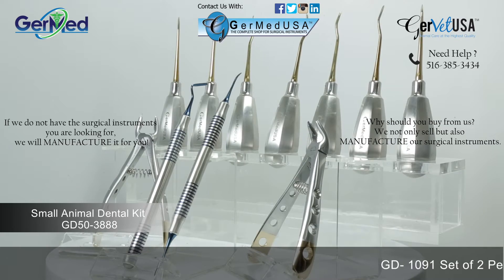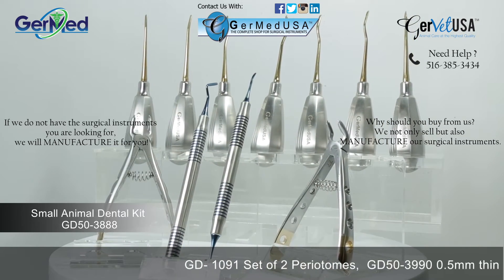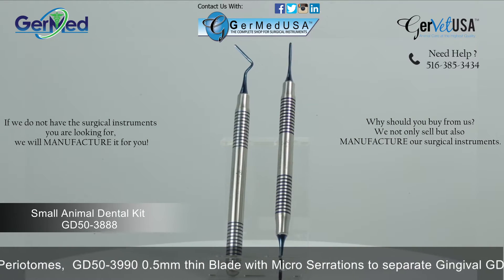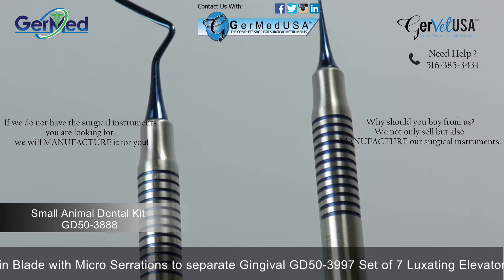Germed provides a small animal atraumatic dental extraction kit which includes 11 pieces. This kit consists of a set of two periotomes in a variety of lengths, angles, and in double or single-ended.